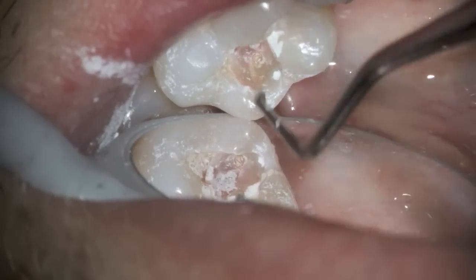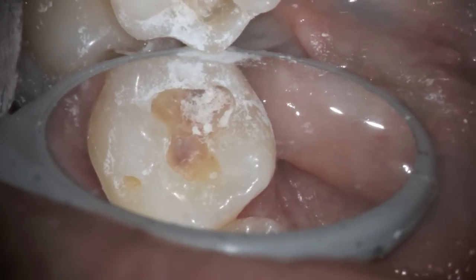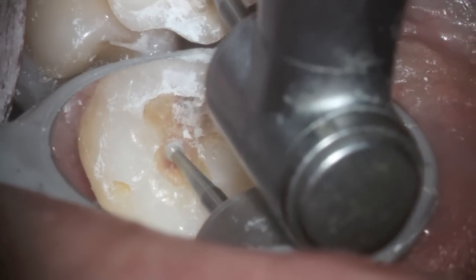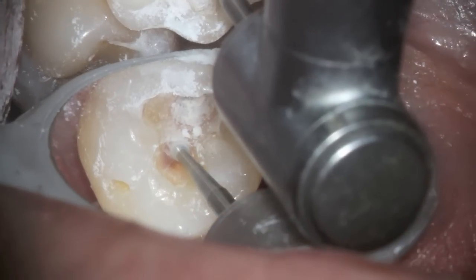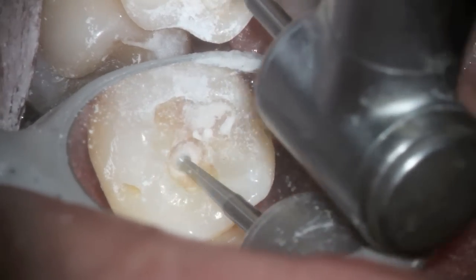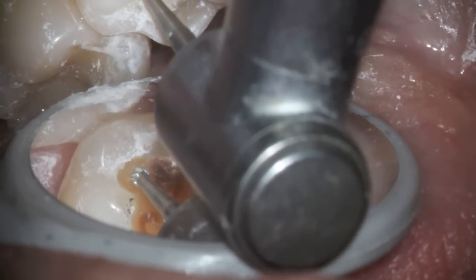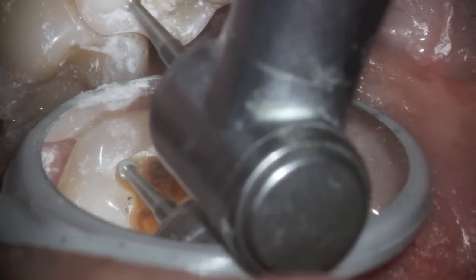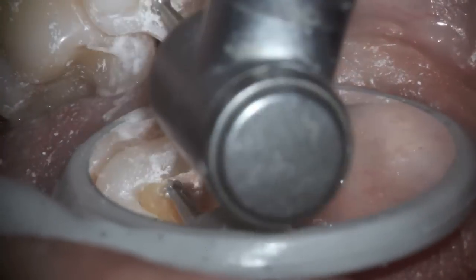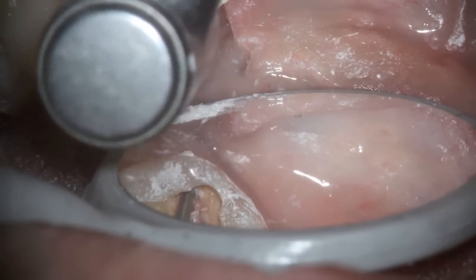The problem with composite resin is that it actually dulls the instruments, so you go through a number of instruments — it takes a lot more time and it's more expensive. I'm using this at a very slow speed; you can see the composite that's still there. You don't want to overheat it, so the RPM on this electric handpiece is really very slow. You'll also notice that periodically we'll use water to keep things cool, but there's still a layer of composite there even before you get down to the brown decay.